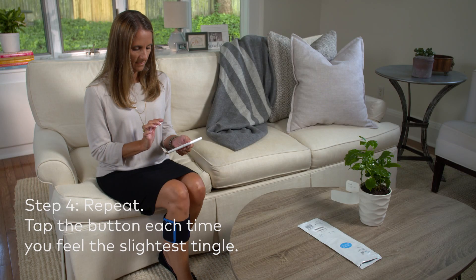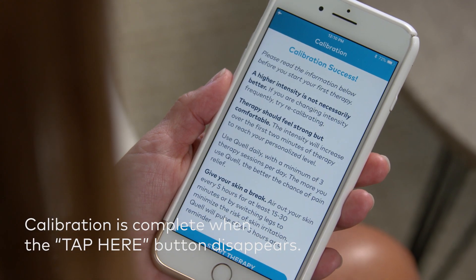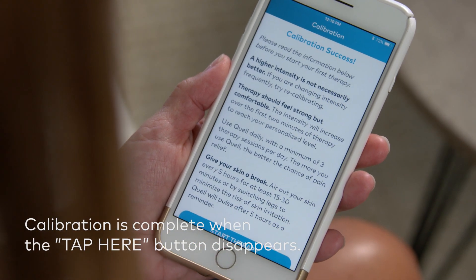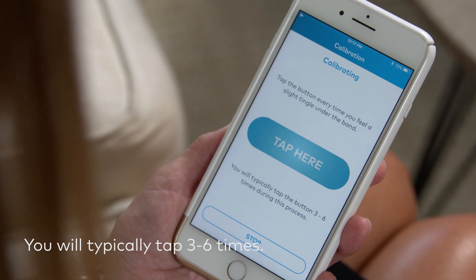Repeat this step — feel a tingle, tap the button — until you see the calibration successful screen within the app. When the "Tap Here" button disappears, you have completed the calibration process. You will typically tap the button three to six times during this process.